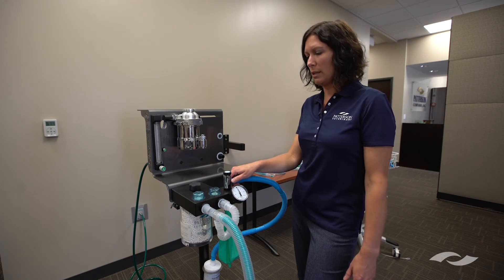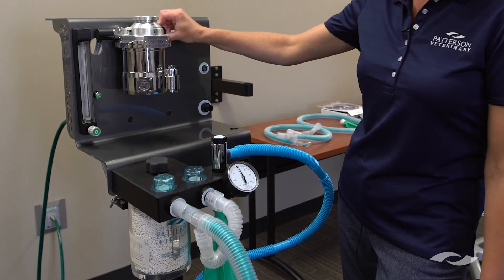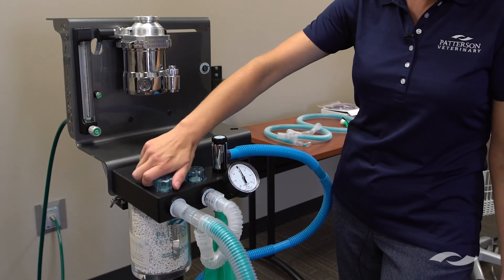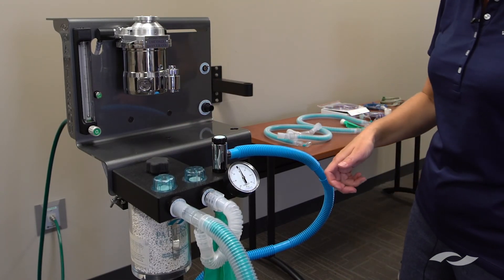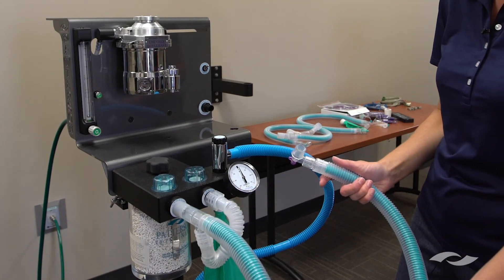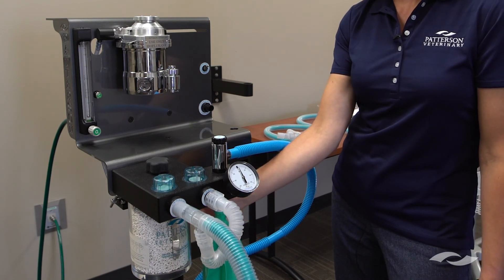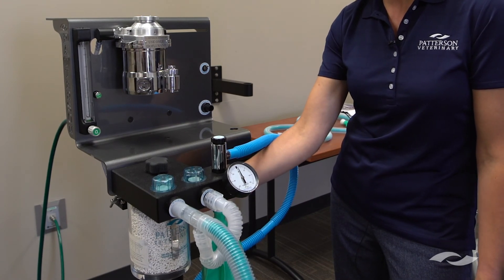If it is dropping more than that, common places to check for a leak are the end caps on each side of the vaporizer — you might just need to push them in and give them a twist to snug them up. The dome caps may also need a little twist to make sure those are snug. The breathing circuit can always be an issue; you might just need to switch out for a different one. Also the breathing bag — you might need to switch that out as well. And the most common place for a leak is the absorber canister, which gets changed out frequently and may just need to be readjusted.